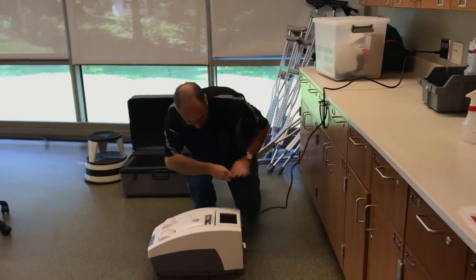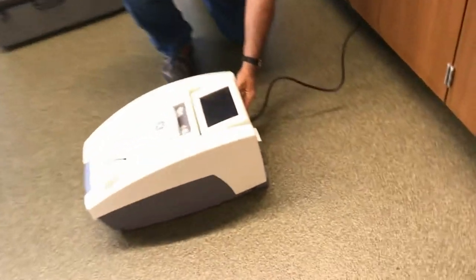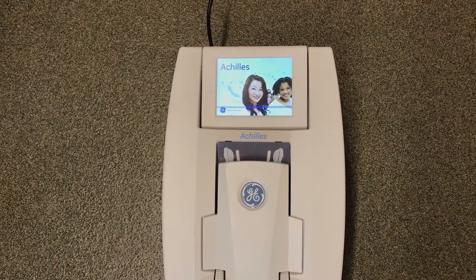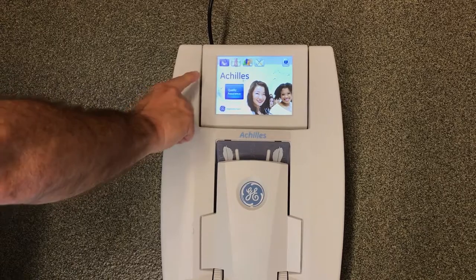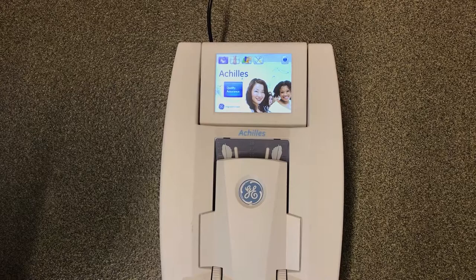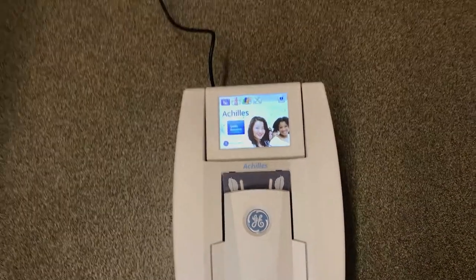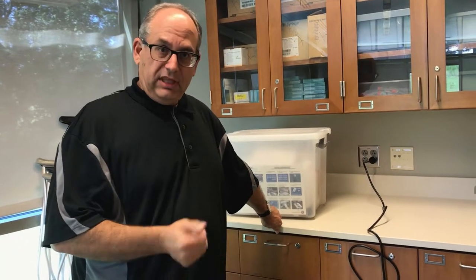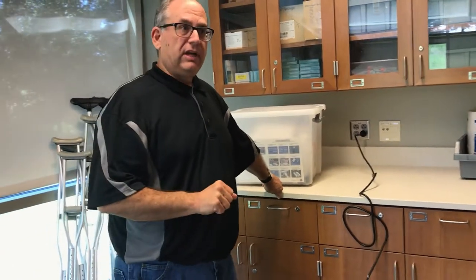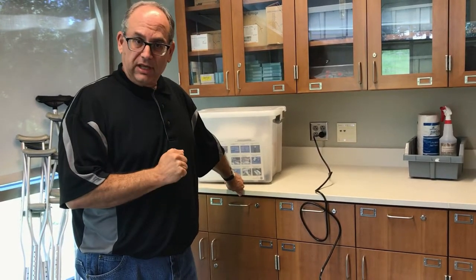Place the machine on a flat, level surface, then turn it on. It's a touch screen and the different options appear on screen. It will immediately indicate that a quality assurance test needs to be performed since the machine was just turned on — you must do that before running any test. You only need to do the QA the first time you power the machine on. If you turn it off or move it, you'll have to re-perform the QA. Once it's done and the machine stays on at that location, you're ready to use it.